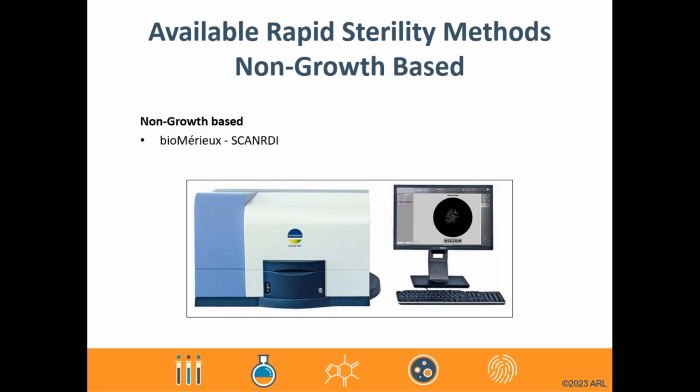One of the most well-known examples of a non-growth-based rapid sterility platform is the Scan RDI. That's also by bioMérieux. With this system, the test sample is filtered through a membrane where any microorganisms that are present are retained on a filter. During the assay, a fluorochrome is released and then retained inside the cells with intact membranes. The equipment then scans the surface of the filter within approximately 3 minutes, where any viable cells are detected. Based on certain system settings, autofluorescing particles, membrane fluorescence, or other background noise are rejected, and a total viable count is reported. It's noteworthy that many firms also include a step where positive results are manually observed using a microscope, and that's done for confirmation of contamination.